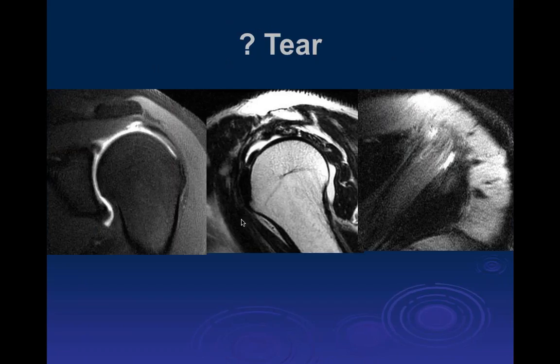Okay. Dashali, what do you think of this case? We have an arthrogram exam with coronal PD fat sat and sagittal T2 and an axial PD fat sat. And so there's contrast going into the undersurface of the supraspinatus tendon in the mid-substance. And then on the axials, we can see it propagating proximally. So this is a partial thickness, moderate articular-sided tear, given the contrast going in.